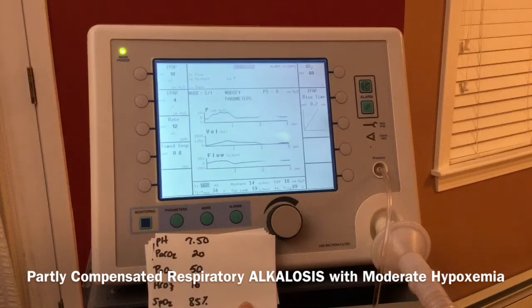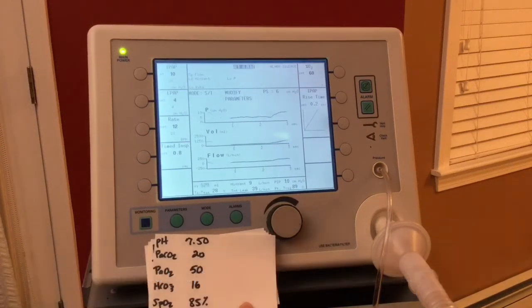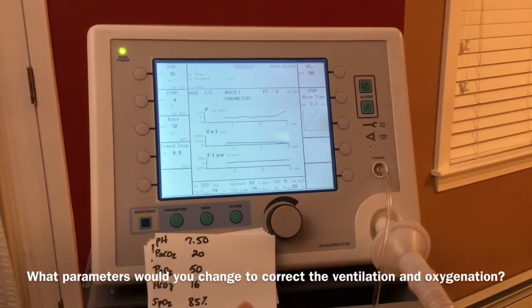Is this a ventilatory or an oxygenation problem? Pause the video. If you said this was a ventilatory and an oxygenation issue, you were correct. What parameters would you change in order to fix the ventilatory and oxygenation issues in this blood gas?